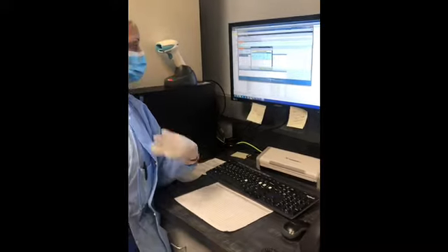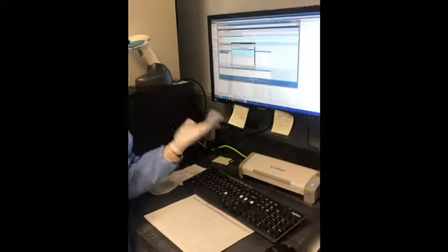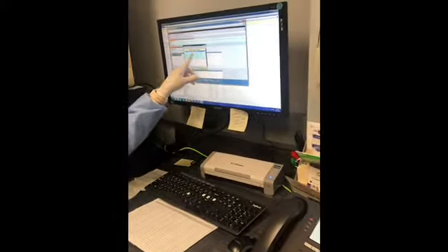What's now? It's mixed with what? It's mixed field in the A, B, and D. Okay. So this is an AB patient. Actually, it's an AB positive patient. So this is your indication that the patient was probably transfused with O negative. So you have an O negative, you'll get mixed field in all three of them.